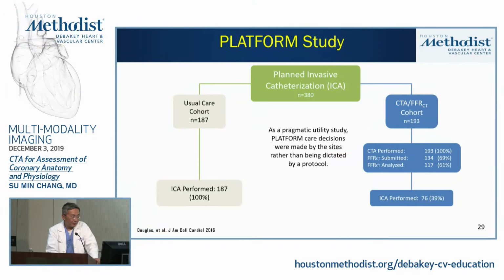And HeartFlow has been very good at funding a lot of clinical studies showing the clinical utility of using FFR derived by CT on top of CTA as a management strategy. This is the PLATFORM study, presented probably several years ago. Basically, the patient was planning to go to invasive cath, so the clinician had already made the decision of sending the patient to the cath lab.